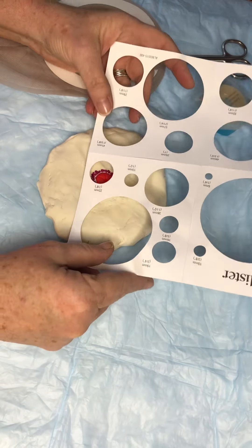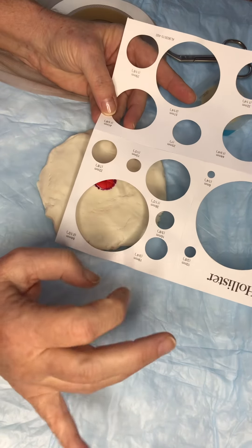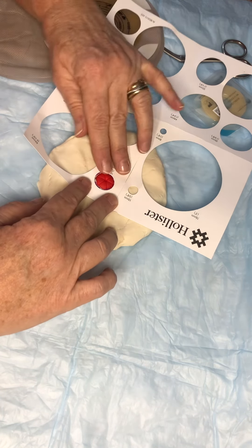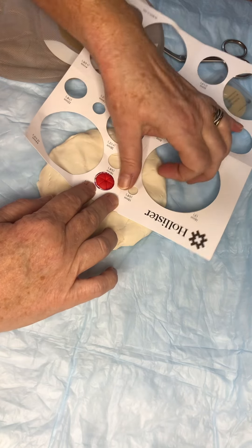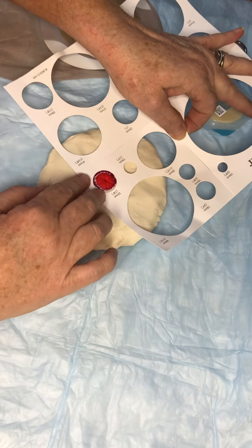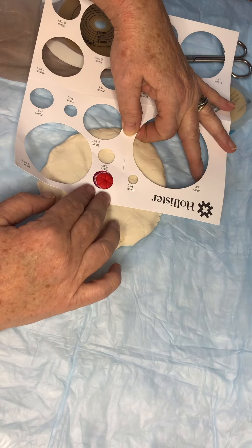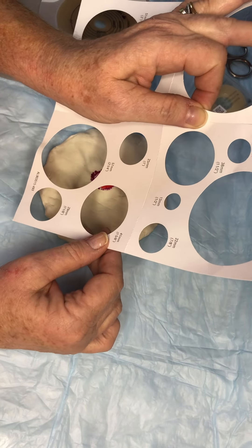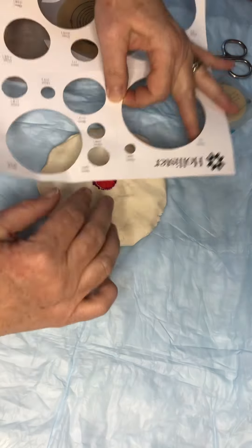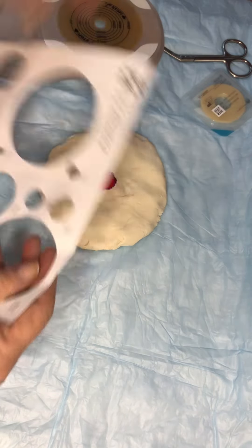So the first thing we're going to do is measure. When I'm talking about measuring, I want it to be the exact size of the stoma - maybe just a tiny bit bigger. That one looks pretty close to the stoma but not touching. This one is way too big. So I'm going to do this again - it's 19 millimeters, three quarters of an inch.